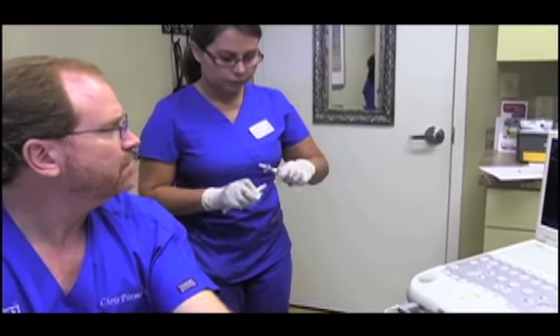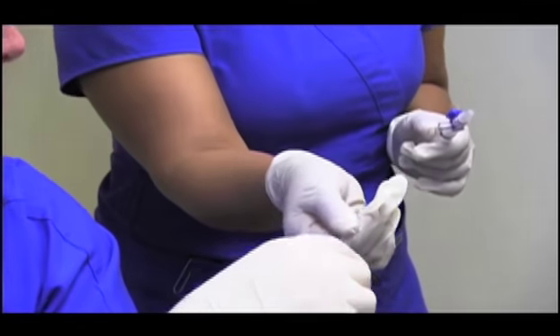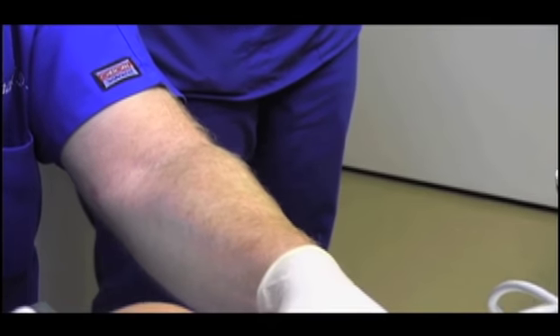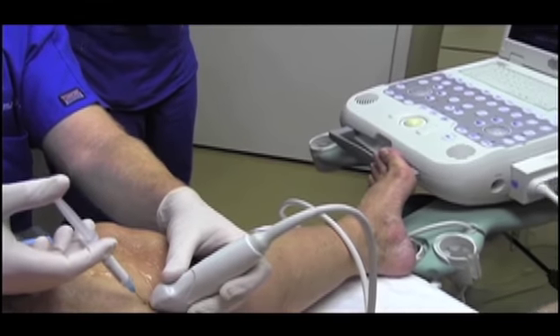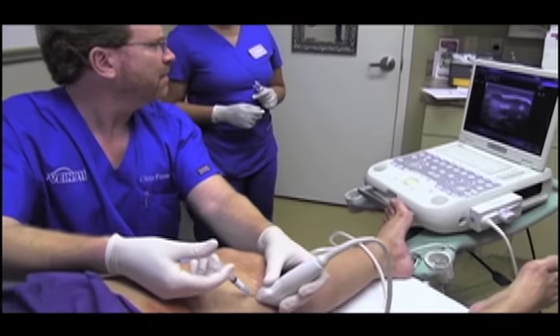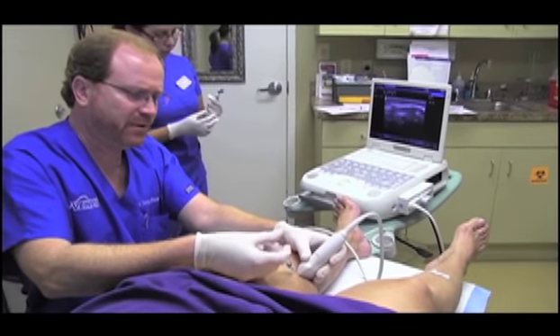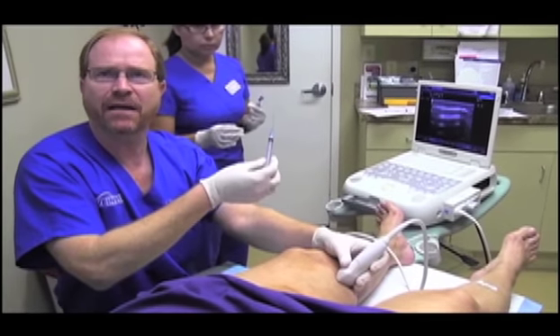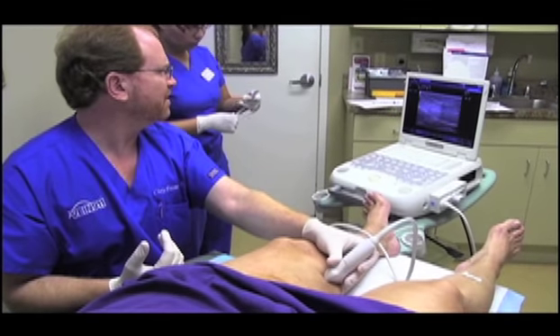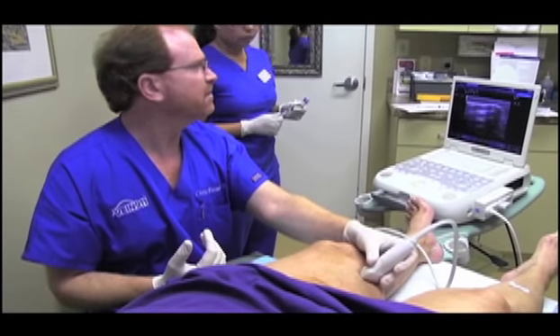Sandra, can you explain what you're doing over there? What Sandra's doing is preparing the foam by mixing the liquid with a little room air, then agitating it — which is the fancy medical term. We want that foam to be fresh. We can't prepare the foam in the morning and use it the rest of the day. It has to be prepared within a minute or two of using it — best when it's fresh.